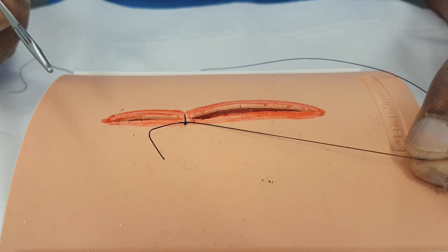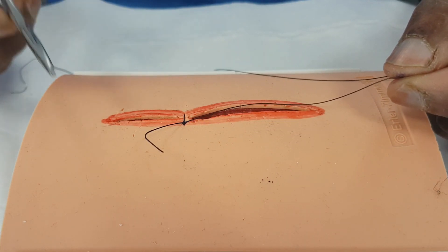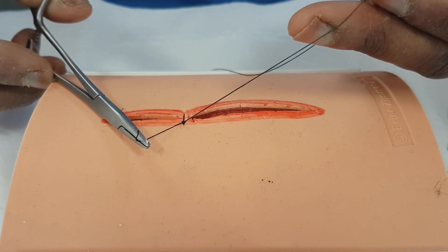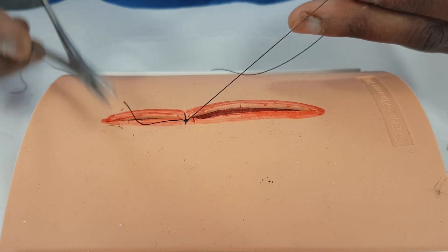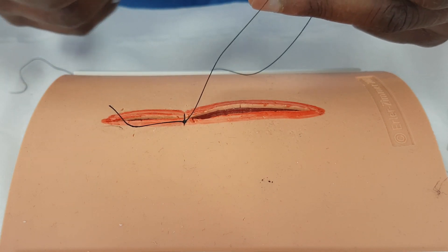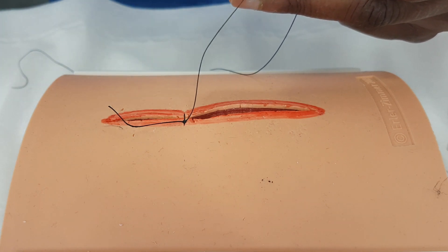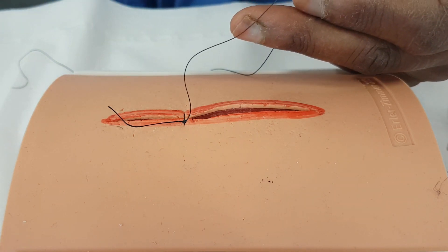I can put in another throw if I want to. Depending on the stitch material, I'm going to change the throws. This is silk — I don't use silk to sew, but we're using it because it's a nice demonstration and you can see the visuals. This is braided, so it sticks to itself — it's rough. If I was using ethylon or proline, that's thinner but also slippery, so I'm going to need to use more knots to keep it together.